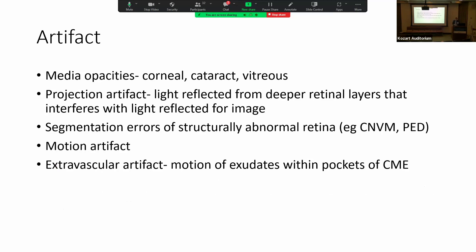Artifact is another disadvantage. Any imaging is prone to issues with media opacity and motion artifact. Some things more specific to OCTA are projection artifact, where light rays reflected from deeper retinal layers interfere with the signal from the item of interest. Segmentation errors can also be a source of confusion during interpretation — for example, if you have a choroidal neovascular membrane or a PED, it may be difficult to discern exactly where the abnormal blood vessels are coming from, and if you rely solely on standard OCTA segmentation, you might be misled. Extravascular artifact can also occur because exudate within pockets of macular edema that are moving will also produce artifact outside of the vessels.